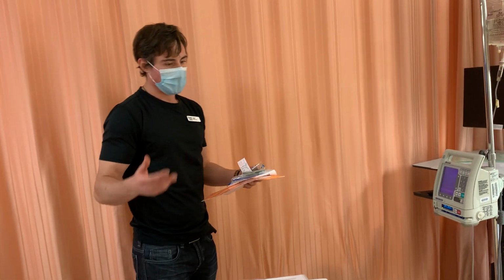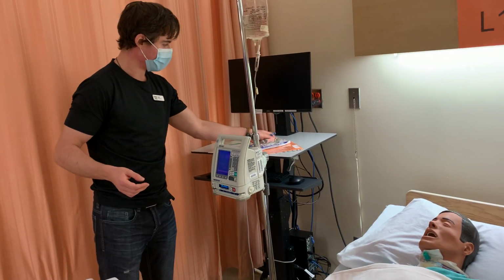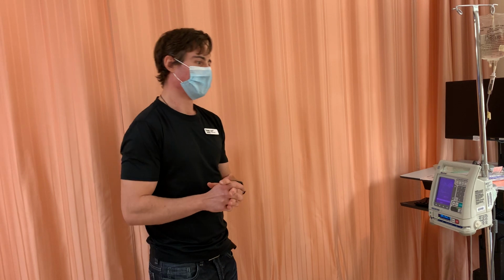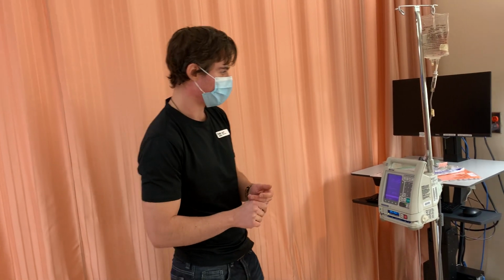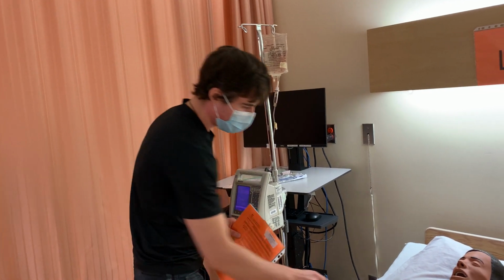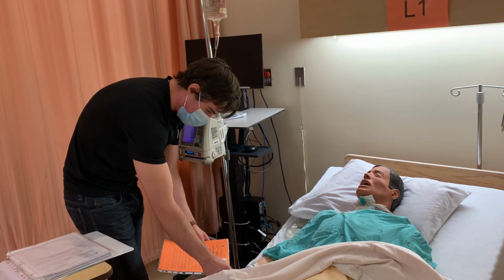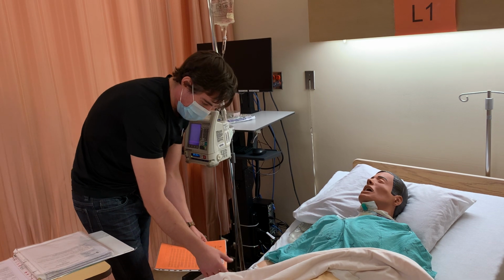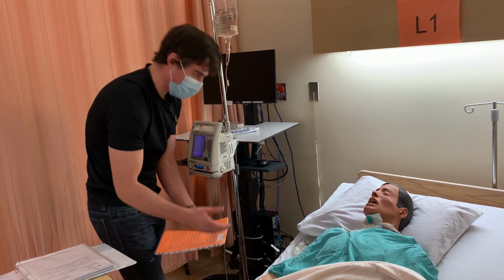Upon entering the patient's room, I'm going to do an entry safety check, making sure the patient's in no distress. I'm going to introduce myself. Hi, I'm Alex Lesiuk, student nurse. I'm here to give you your IV medication today. Could you just state your first and last name for me? So she would verbally state her first and last name. So we got Vancomycin, and I'm comparing to the MAR, Vancomycin, birthday of 20 October 1960, that matches.